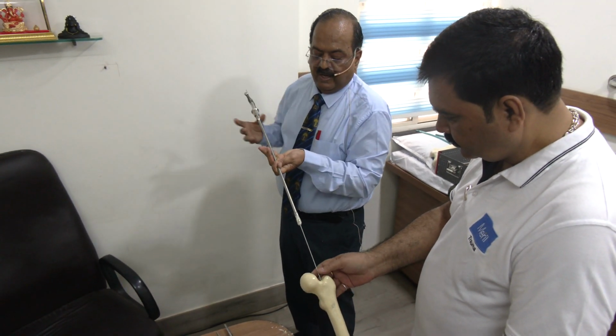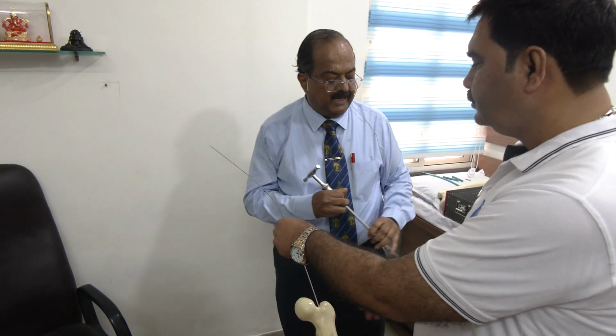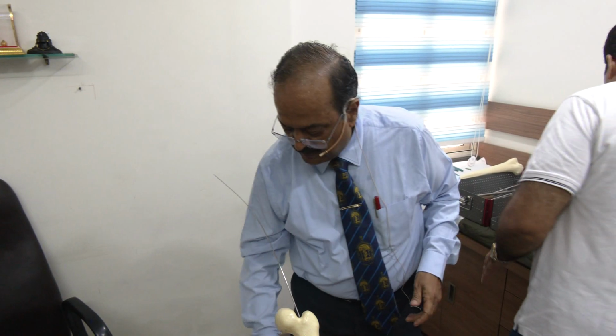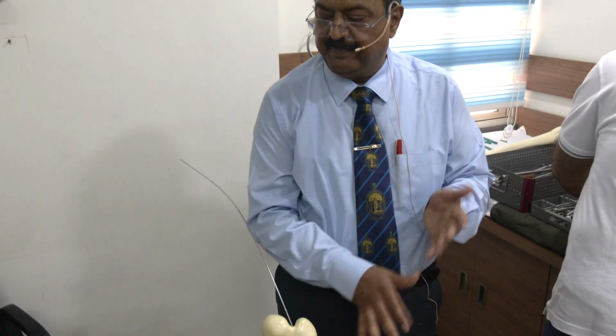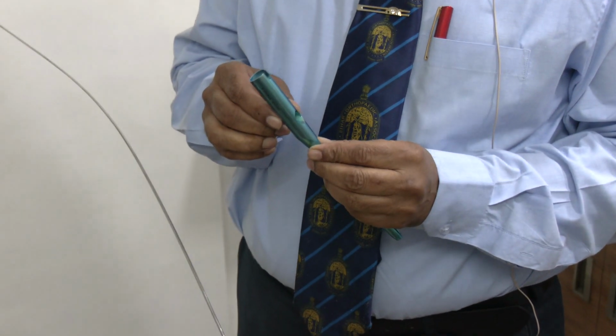Okay, now the reaming part is over. Now the nail, give me the nail, jig, assemblies, everything one after the other. Give me the nail in my hand. This is the nail which we are going to pass.